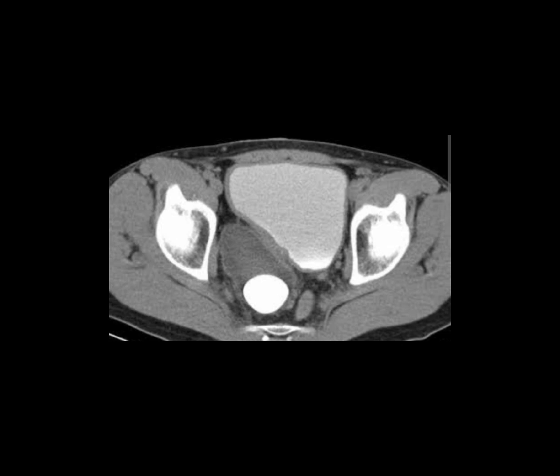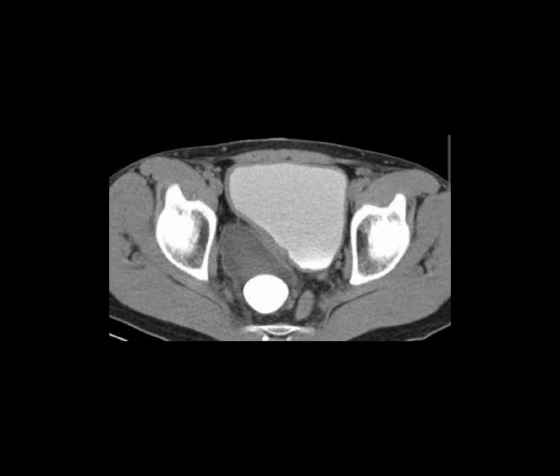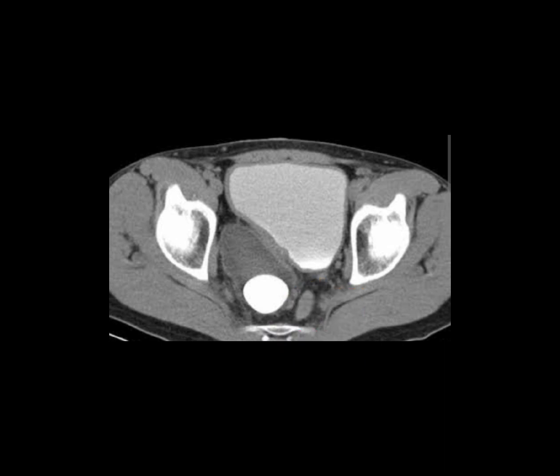Here we can see a CT examination of the pelvis. On post contrast study we can see contrast within the urinary bladder, while a prominent sized diverticula is noted along the right posterolateral aspect of the urinary bladder, which shows a well-defined secondary stone in it. We cannot see contrast in this diverticula.